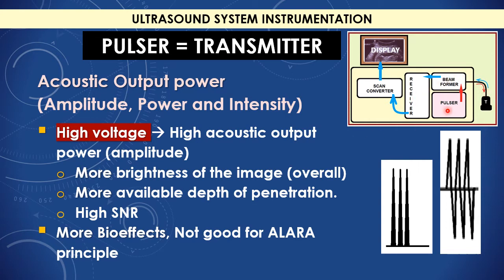So signals are coming from the patient. So what is the noise? Noise is coming from where? Noise is coming from the surrounding of the machine, electronics around the machine. Anything that is running by electricity will create an electromagnetic field around it, and this will give some noise when they are transmitted through the cord toward the machine. So I will get here electric noise, sometimes called contamination or interference.